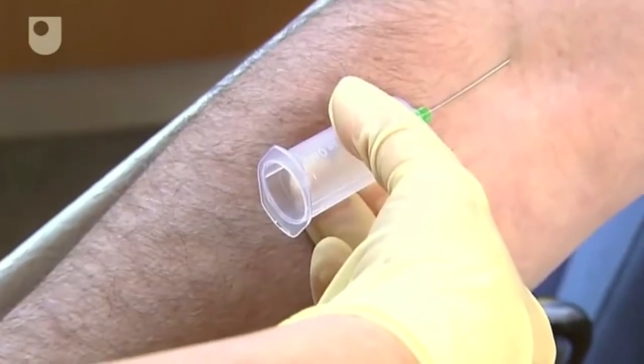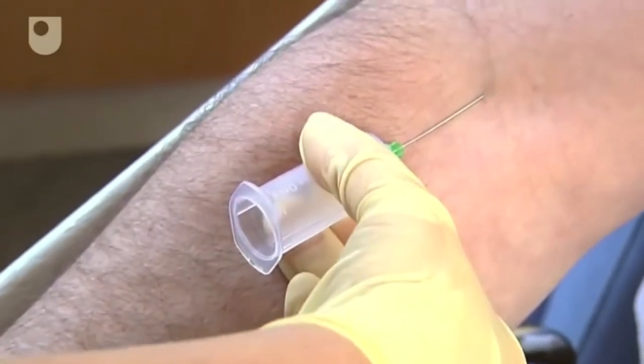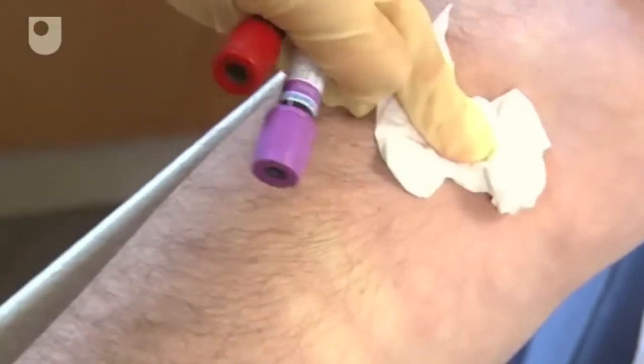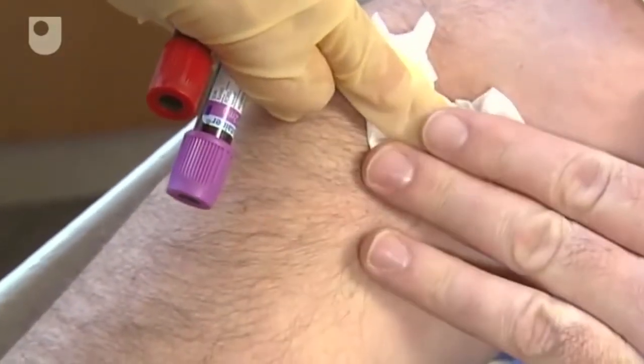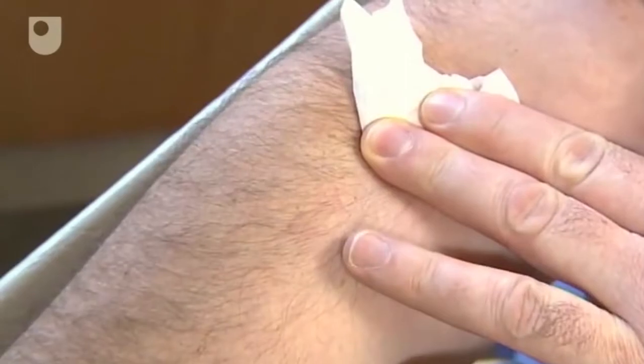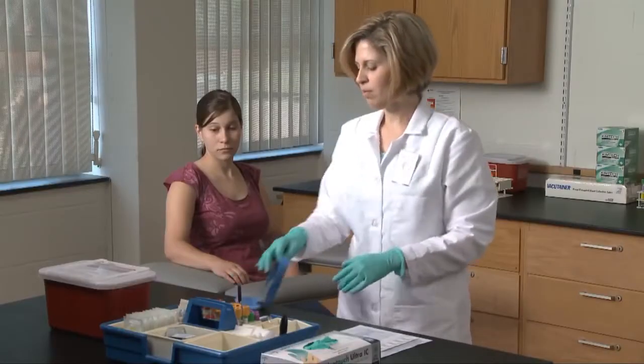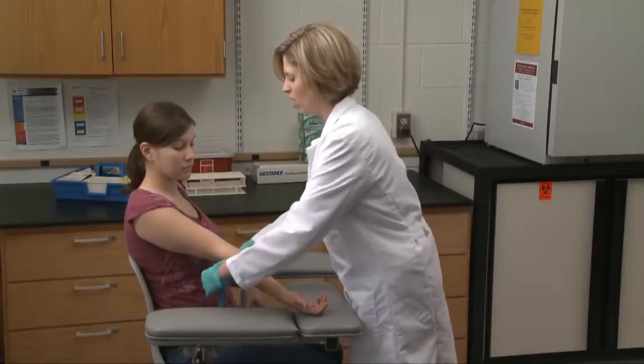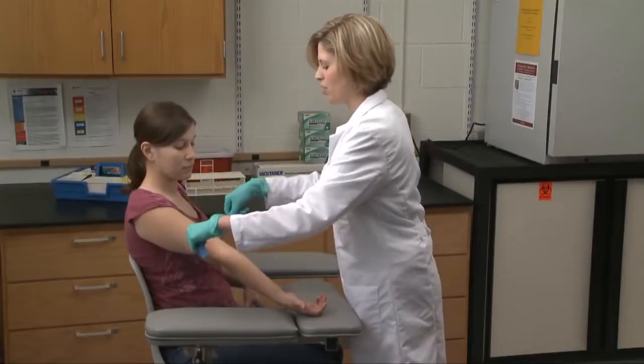Okay, if you'd like to just relax your arm for me, just taking the tourniquet off and just squeeze on the tissue for me, okay? I'm all set here. If you'd please straighten your arm. It'll just take a moment while I apply the tourniquet.